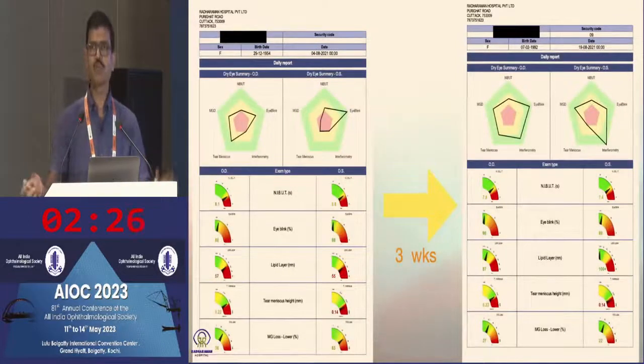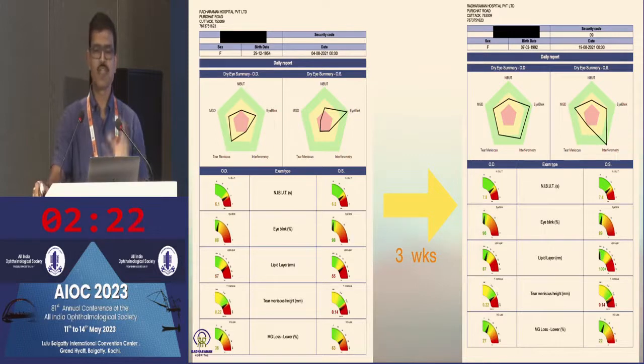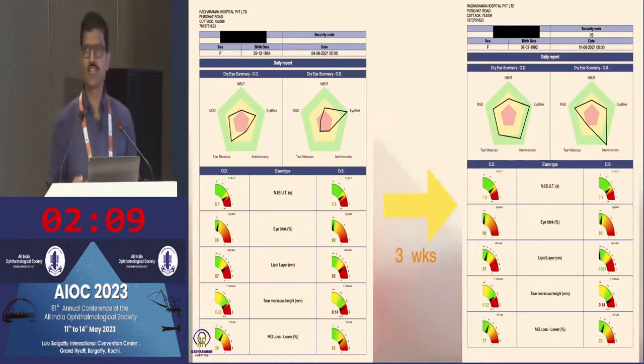And finally, before I sign off, this is also something that we must look at, the ocular surface. If we have access to the ocular surface analyzer, dry eye suite, then wonderful. If not, then we can do certain simple tests to rule out whether the ocular surface is doing well or not. This is one such patient who also had qualified otherwise for a trifocal implant.